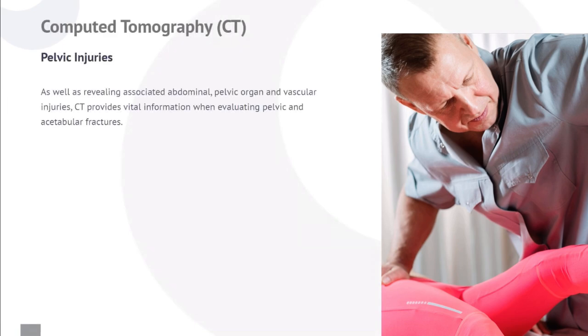Pelvic injuries. As well as revealing associated abdominal, pelvic organ and vascular injuries, CT provides vital information when evaluating pelvic and acetabular fractures. Knee injuries. CT is particularly helpful when evaluating tibial plateau fractures.